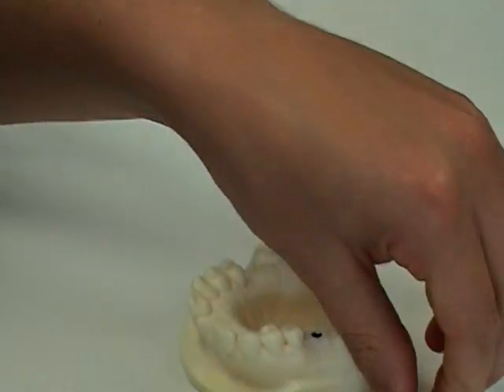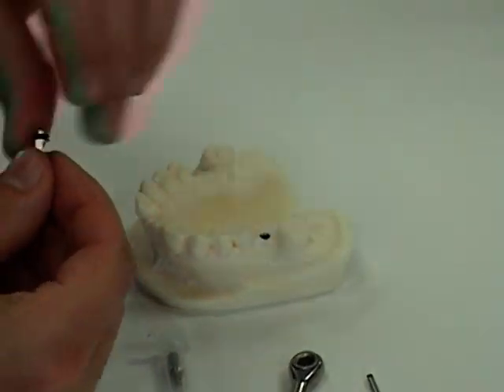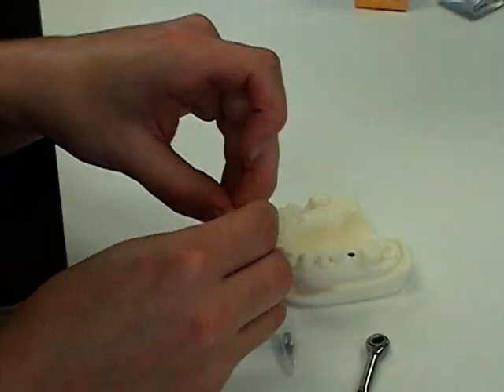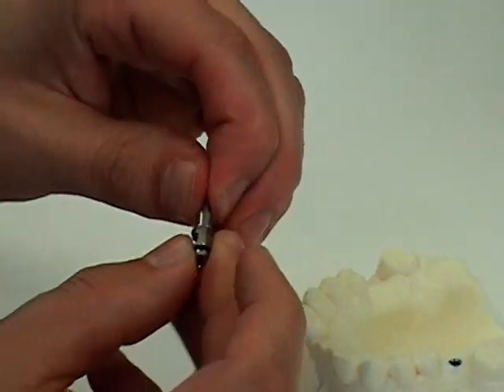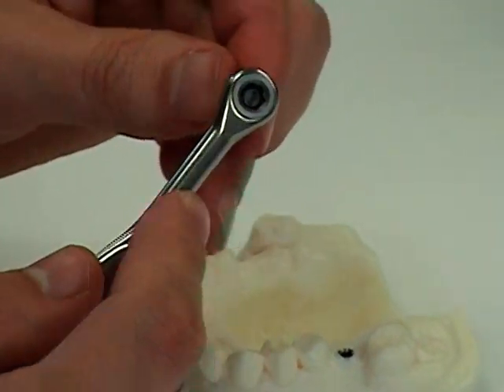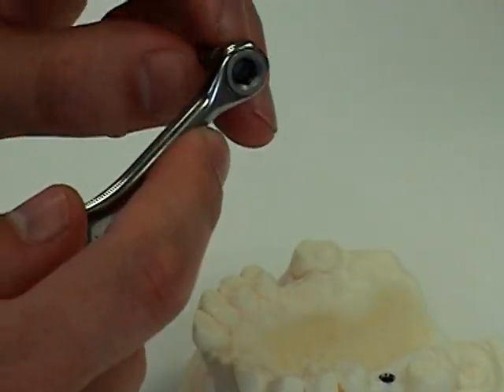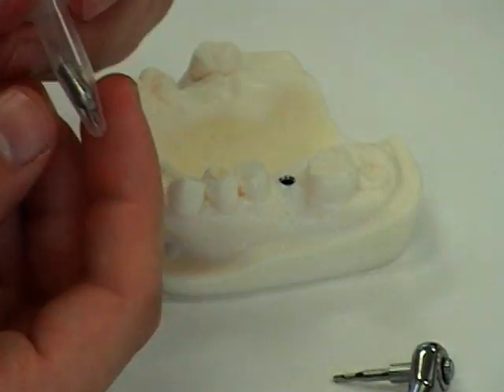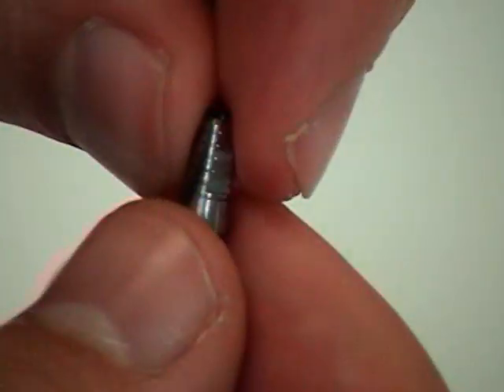We will assemble the adapter along with the hex driver together and insert it into the wrench. Here's our abutment with screw in place.